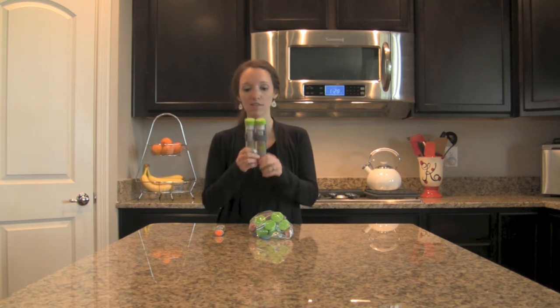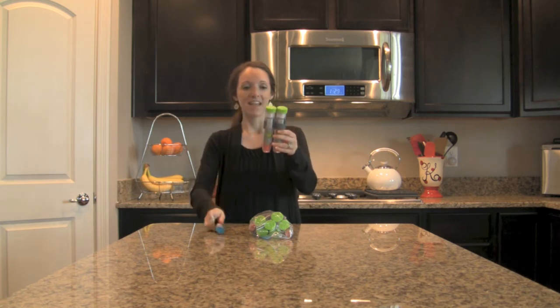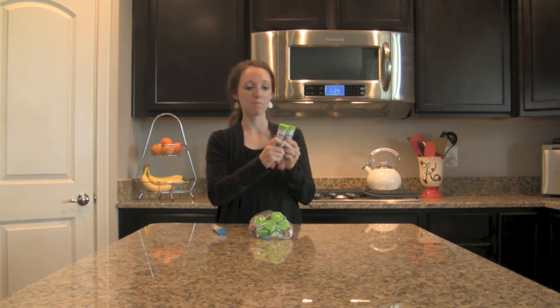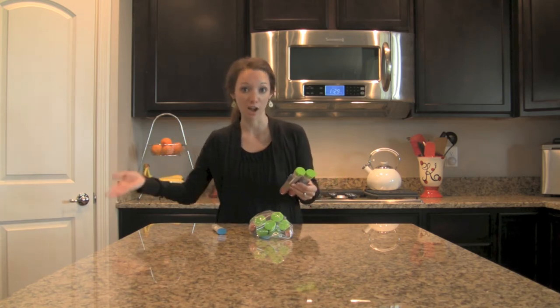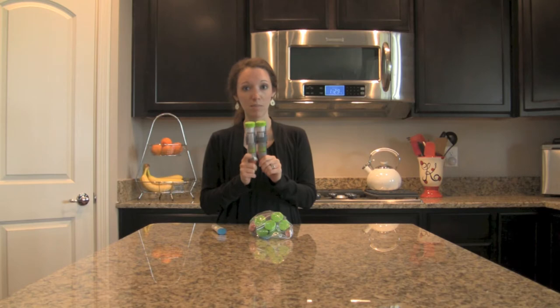Most of the time when EpiPens are prescribed they will come in a two-pack. They come in a green box with a training device. The reason there are two is that statistics have shown that after you administer the first one, if paramedics do not arrive in time you may need a second dose. So it's always better to have two — you will never be sorry for having too much, you will always be sorry for not having enough. They recommend that every child carries two EpiPens on them at all times.